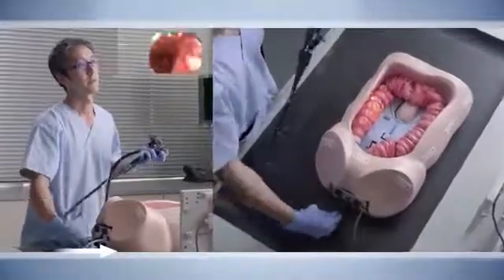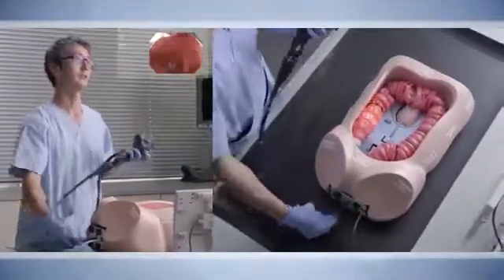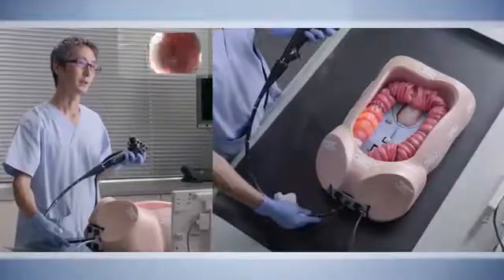And you finish the total colonoscopy like this.